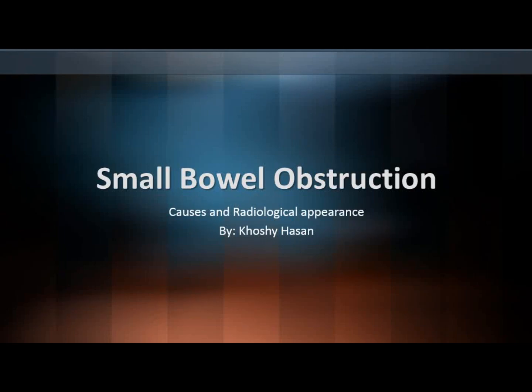Okay, so in continuation of our abdominal imaging, we will talk shortly about the small bowel obstruction causes and radiological appearance by Dr. Khoshi Hassan. Hi, everybody. The presentation of today will be about the small bowel obstruction. It's a nice and brief presentation.